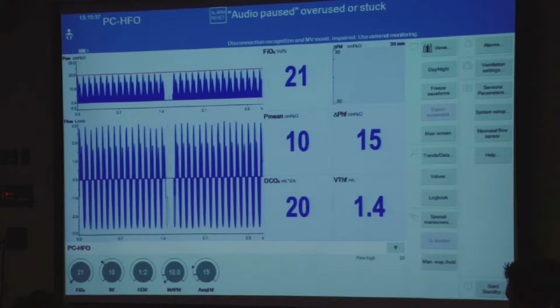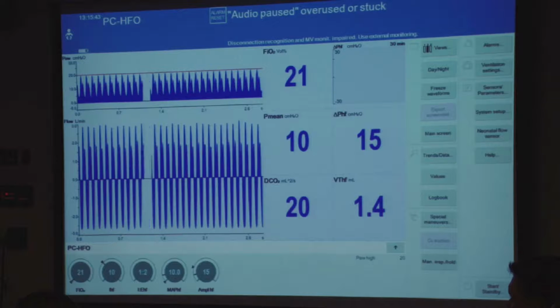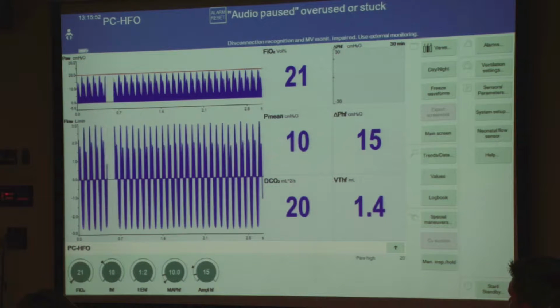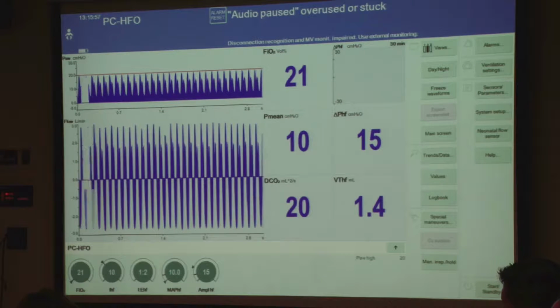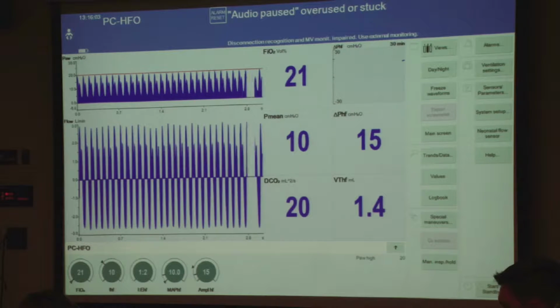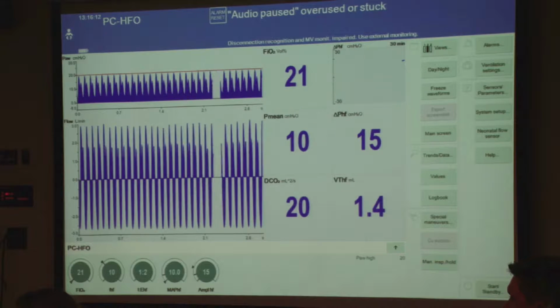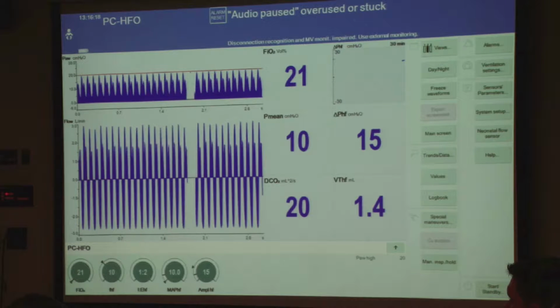And that's very important, because when you max out the ventilator, the only way you can tell you're at this point is that if you keep increasing your amplitude, this number can increase, but this one won't. It will reach a point where you dial more amplitude, but nothing truly happens with the patient. And remember, we had a very good and well-trained person moonlighting in our unit, and she didn't know this ventilator so well.